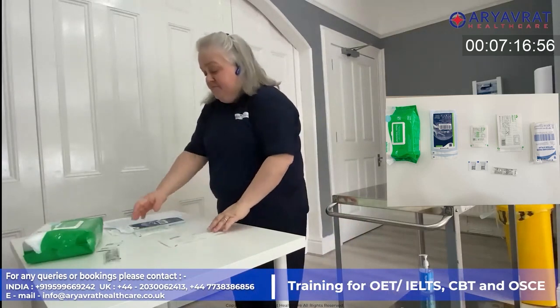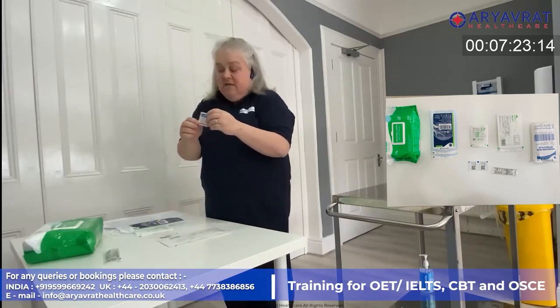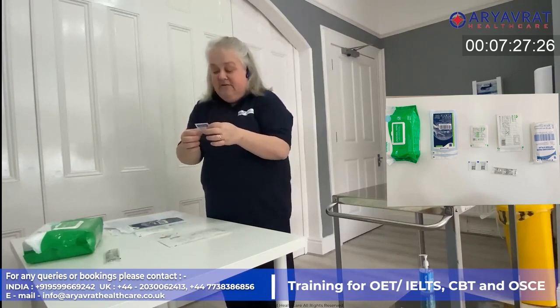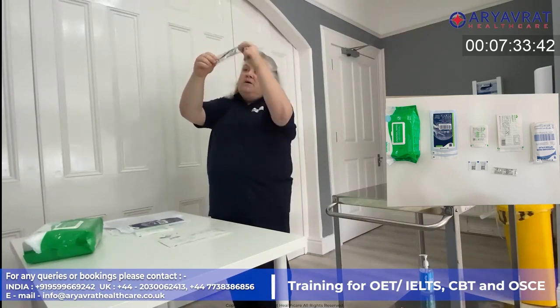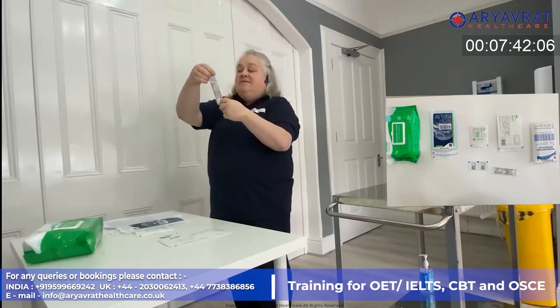I will need an alcohol swab. So I'm checking that it's intact and in date, 07/24, and I will need a sachet of normal saline, making sure that there's no cloudiness or particulate in there, and checking the date on this one, which expires 04/2022, so I need both of those on here.